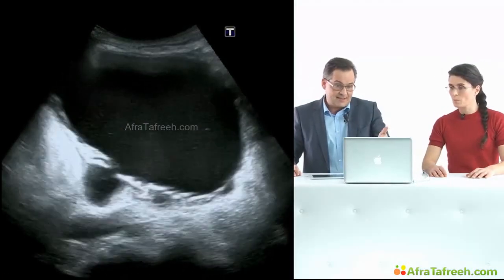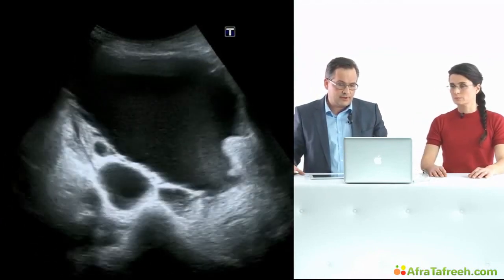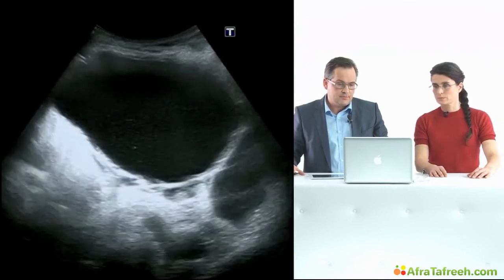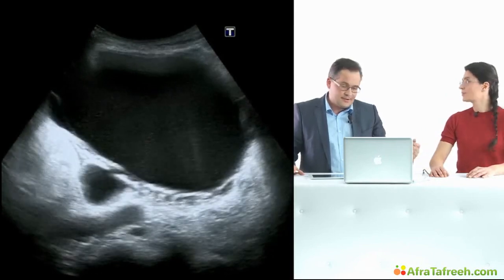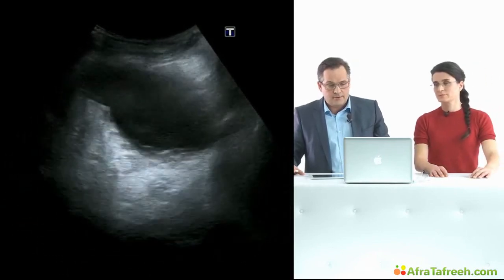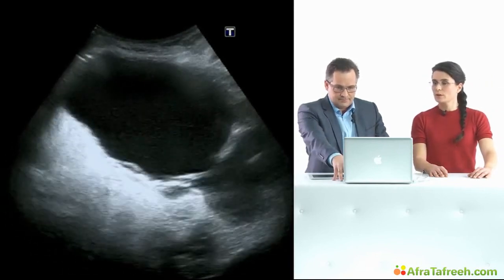Indeed. And that's the scan of his bladder. You can see this whole great organ filled with urine. So we were asking, how could this be? The patient had got a urinary catheter before. I suppose so. So I can't detect a catheter balloon in this clip.